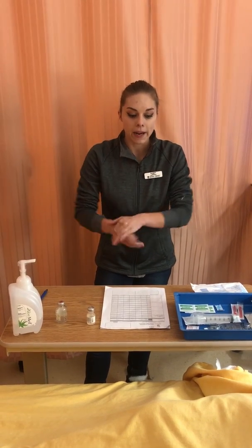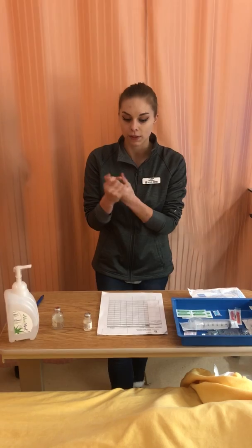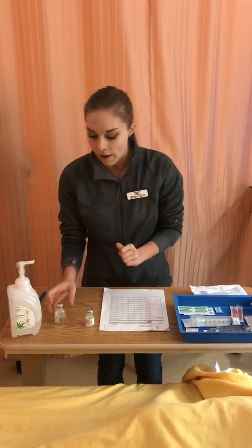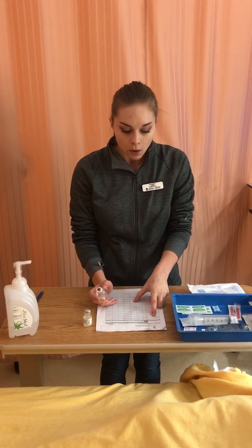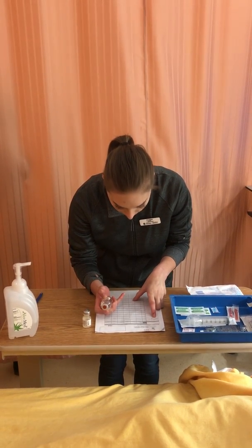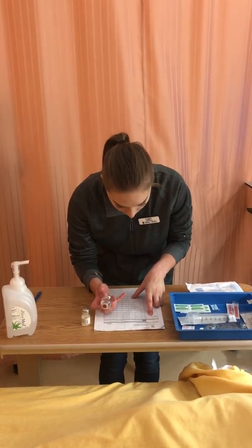I have also compared my doctor's order to my MAR to make sure that it was transcribed correctly. I have also pulled my medication from the Pyxis machine, and I'm going to do my first check. So I've grabbed a 5 million unit vial because my ordered dose is 3 million, so I know that I have enough in here. So it is penicillin G. This is good for IV administration.